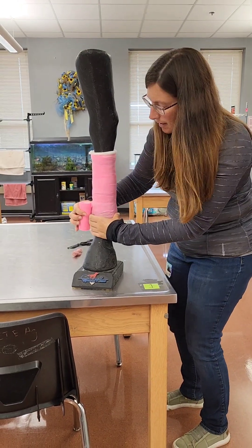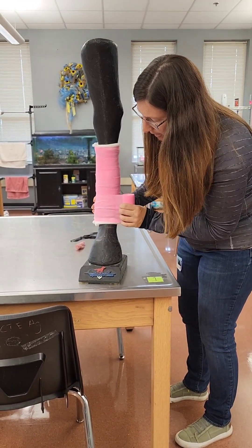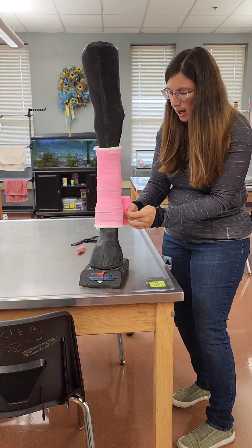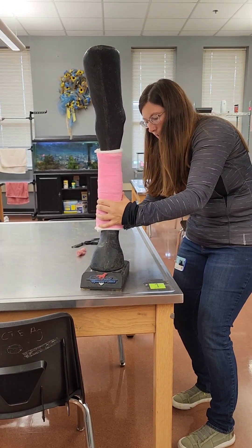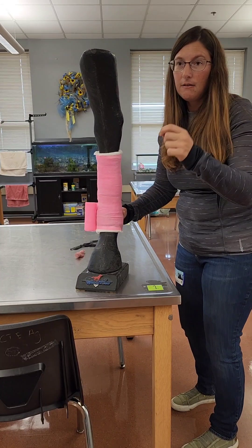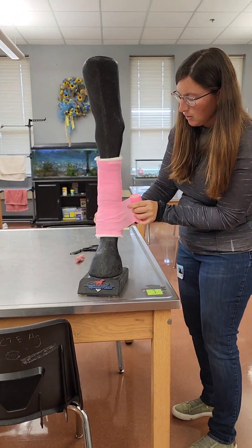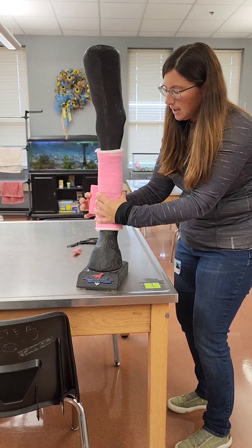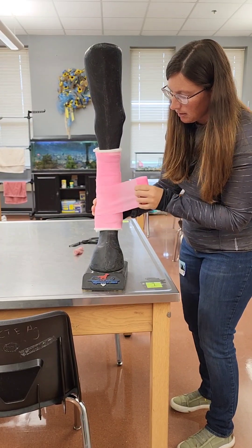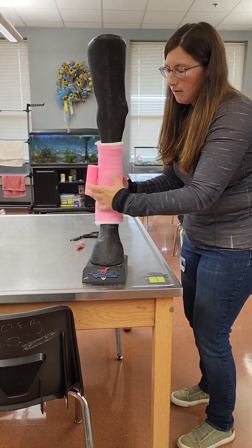Come down around the bottom joint, again covering your brown gauze but not covering your roll cotton. You want to leave the roll cotton exposed so that you don't choke that leg with your vet wrap, because it can get very tight and restrictive on the skin. Then you are going to roll back up in the same way using half-width layers and a flat, even pressure.